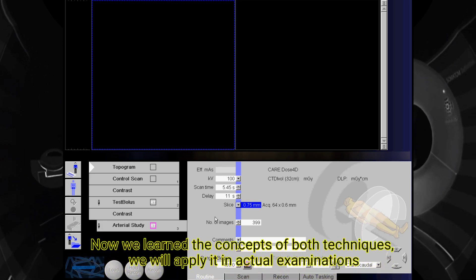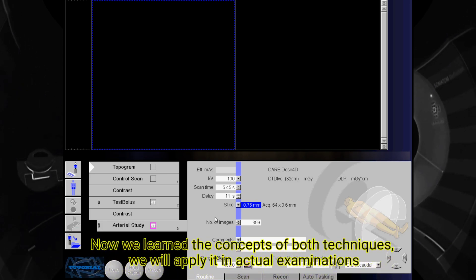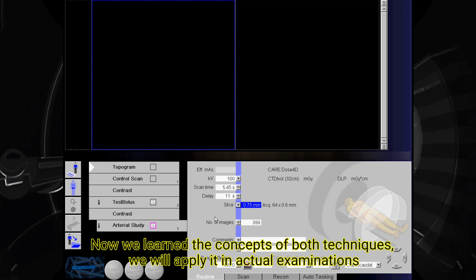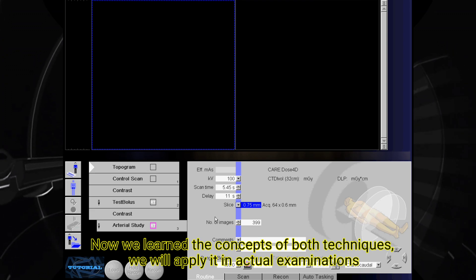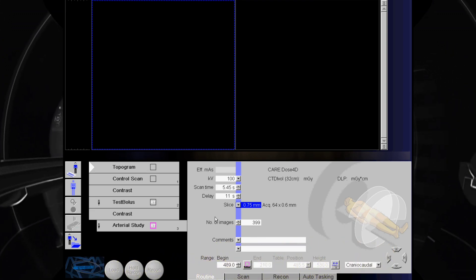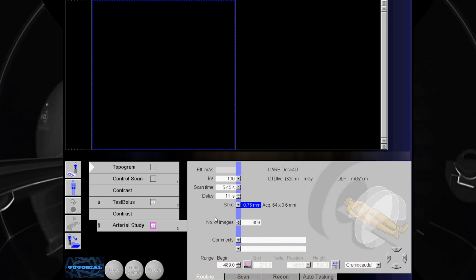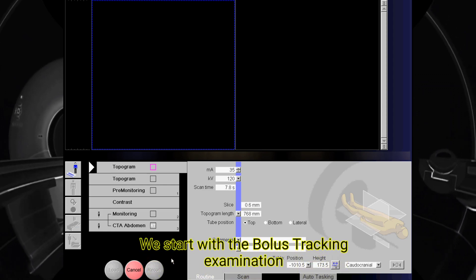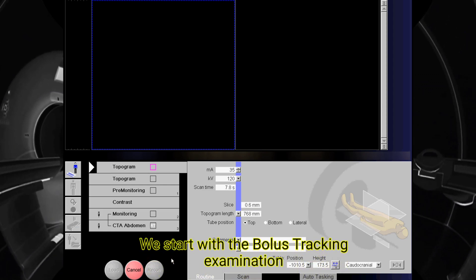Now that we have learned the concepts of both techniques, we will apply them in actual examinations. We start with a bolus tracking examination.